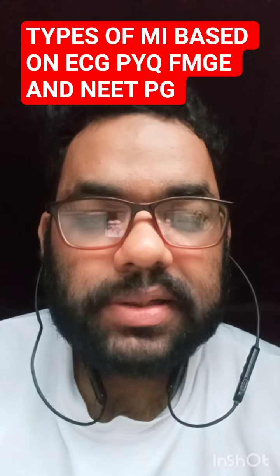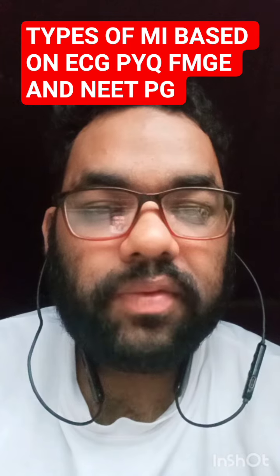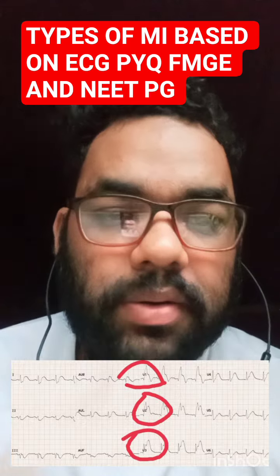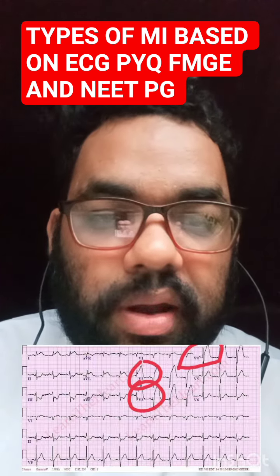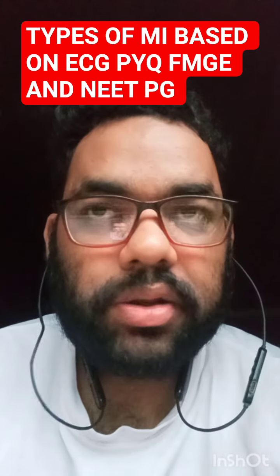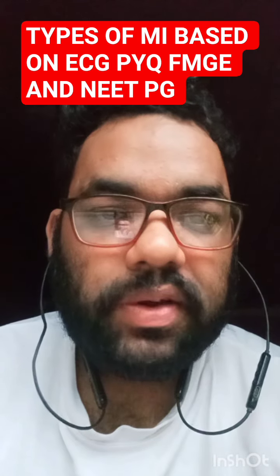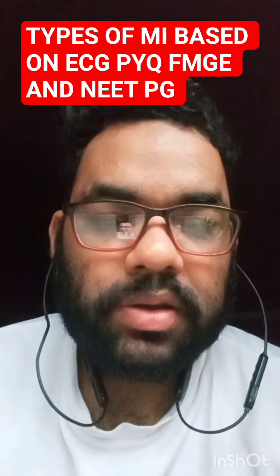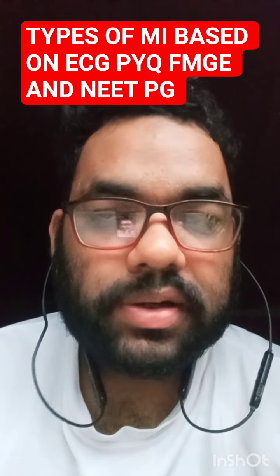And as far as the different ECG leads are concerned, for example, if we get to see ST elevation in leads V1 and V2, then there can be septal AMI, involving the interventricular septum. And if we see ST elevation in V2 to V4, then that can define the anterior AMI, right? And if we see V5, V6 and further, that defines the lateral AMI, right? So these are the different kinds of ECG leads and the types of myocardial infarctions on the basis of the leads.